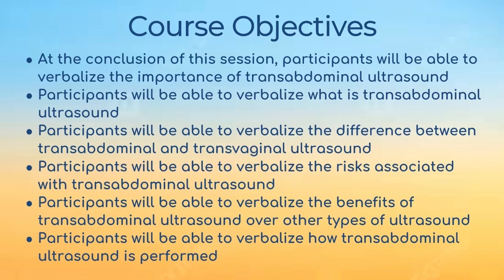At the end of this session, participants will be able to verbalize the importance of transabdominal ultrasound. You'll be able to verbalize what transabdominal ultrasound is and what it entails, the difference between transabdominal and transvaginal ultrasound, the risks associated with transabdominal ultrasound, the benefits of transabdominal ultrasound over other types of ultrasound, and how transabdominal ultrasound is performed.